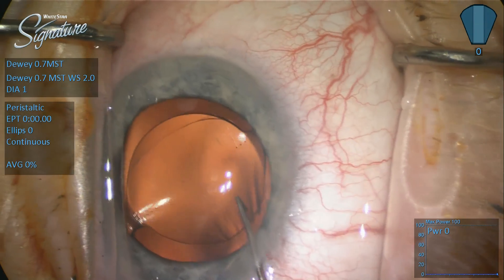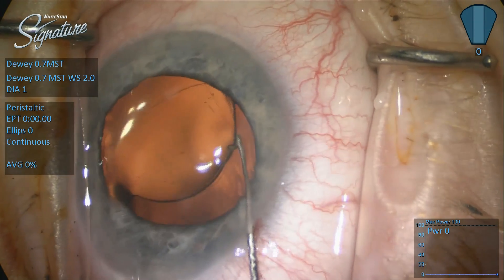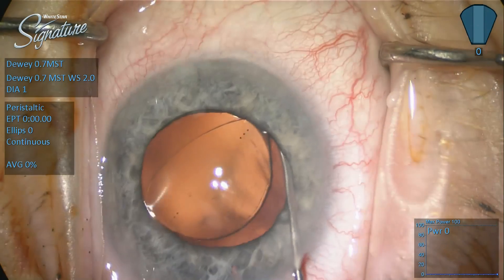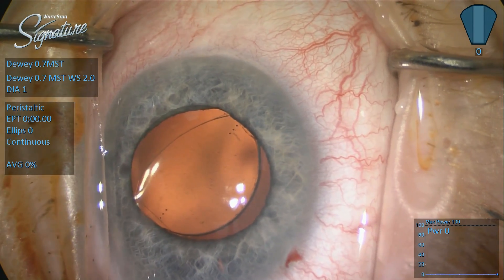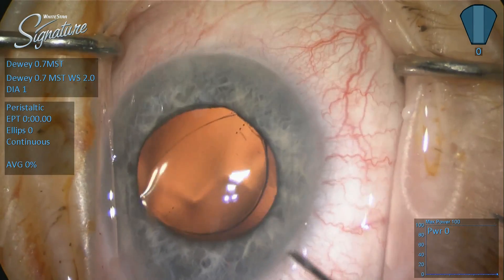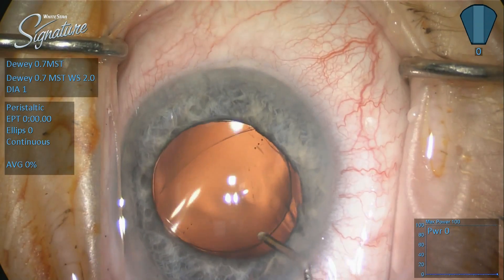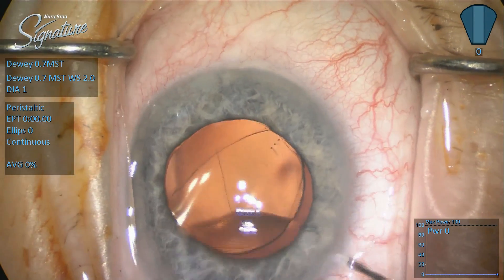Once I feel pretty comfortable that I've achieved that, I'm going to hook the temporal edge of the optic, lift it up, and raise it over the edge of the capsule. It centers actually exceptionally well. I really attributed this to the wonderful circularity, the wonderful centration, and the intact nature of the capsulotomy created by the Catalyst femtosecond laser.